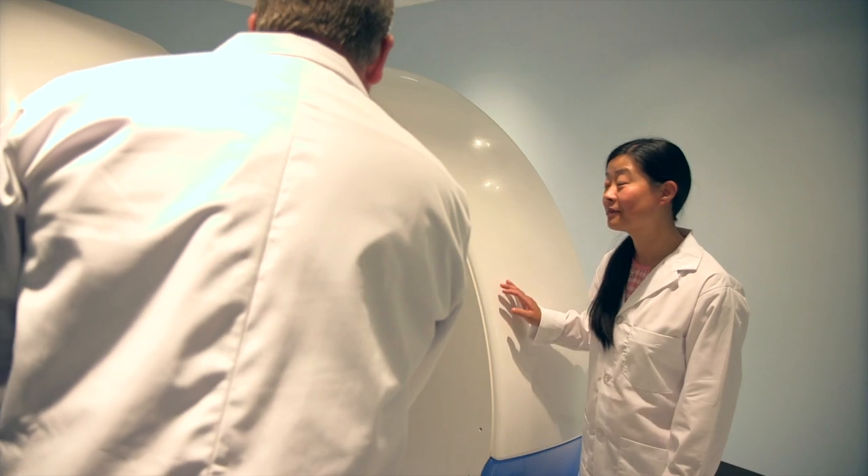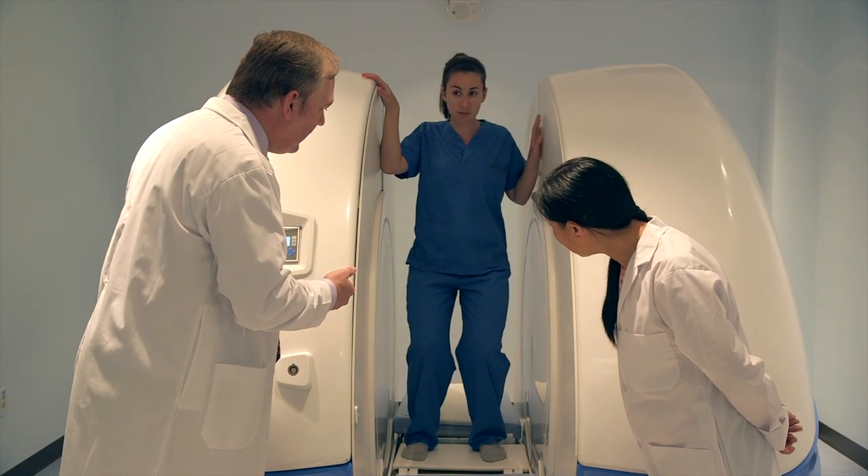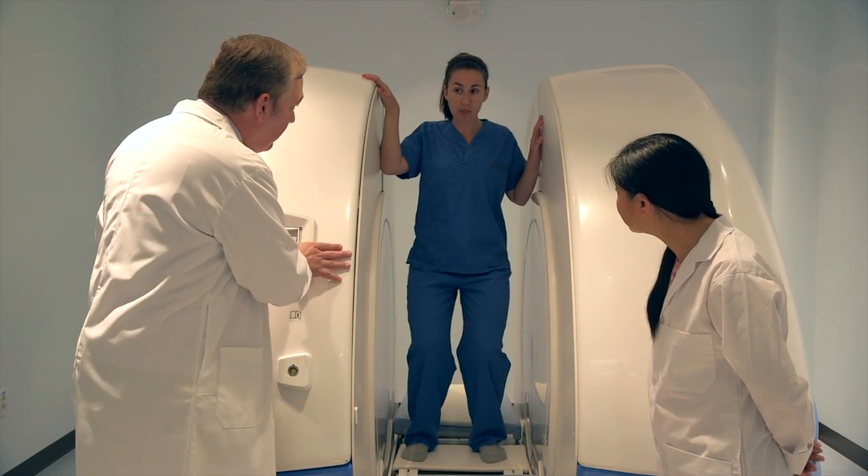What's unique about our open upright MRI scanner is it lets us scan people in everyday postures like standing, sitting and squatting. In a normal MRI scanner you can only scan patients when they're lying down, but if you experience joint pain you know that you experience it most strongly when you're actually using your joints. What the scanner lets us do is image people in those postures when they're actually experiencing the pain, and that gives us much more insight into what's causing their pain and their joint degeneration.